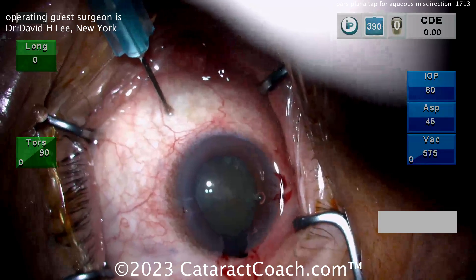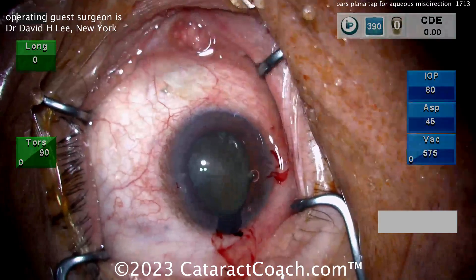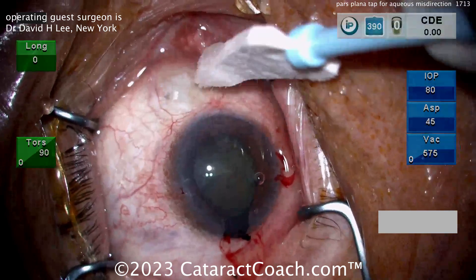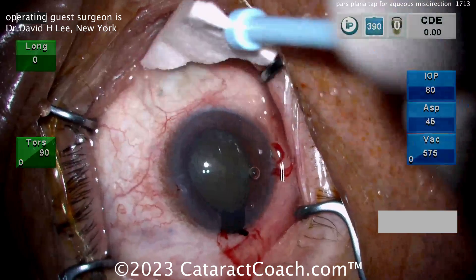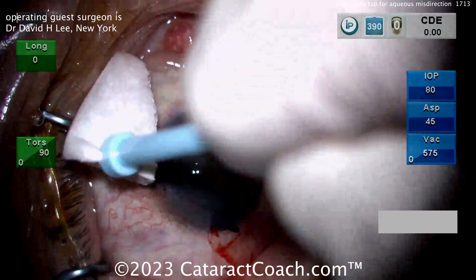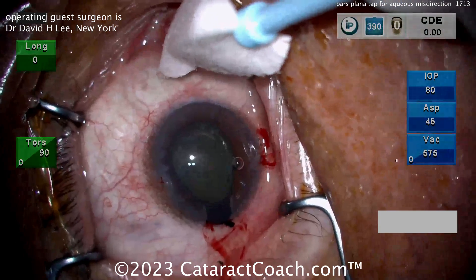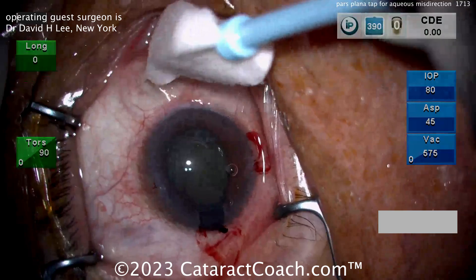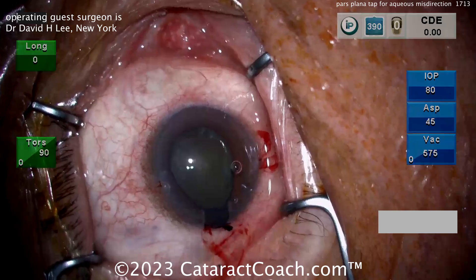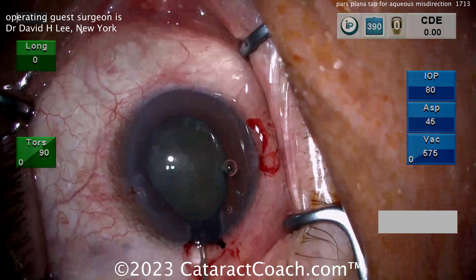Once that's aspirated out, look — you can see the AC is already deepening, which looks great. Come out of the eye. Another pearl: pull the conjunctiva to the side first so that the hole in the conjunctiva is not directly above the hole in the sclera. Now that that's resolved, look — even more fluid is leaking out from that pars plana tap site. More pieces coming out. Great call on this case — beautiful call, I like the judgment here.